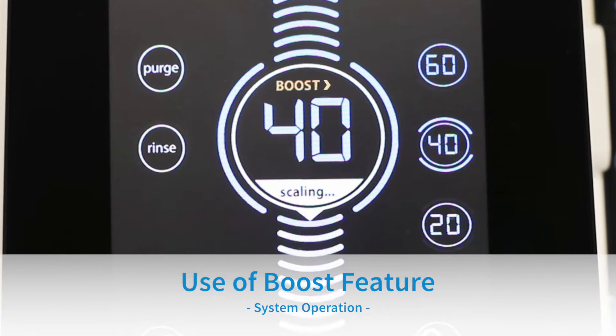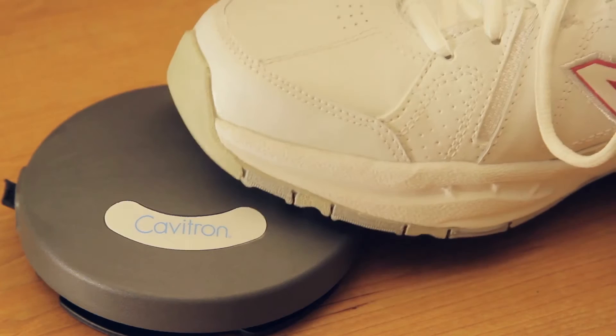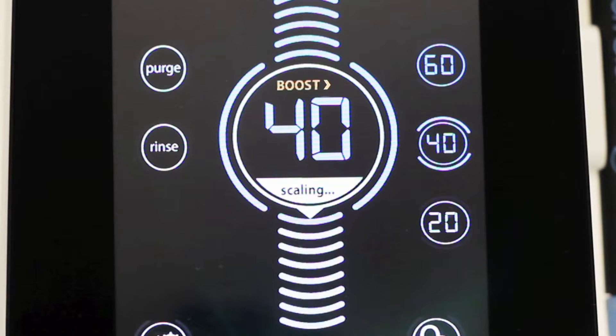Use of boost feature: The boost feature provides a temporary increase in ultrasonic scaling power for quick removal of tenacious calculus without actually touching the unit. Boost is activated by fully depressing the tap-on foot pedal to the second position. When boost is activated, the boost icon will illuminate on the power level bubble. Boost will remain on as long as the clinician has the foot pedal pressed all the way down. To deactivate boost, release the tap-on foot pedal to the first position.